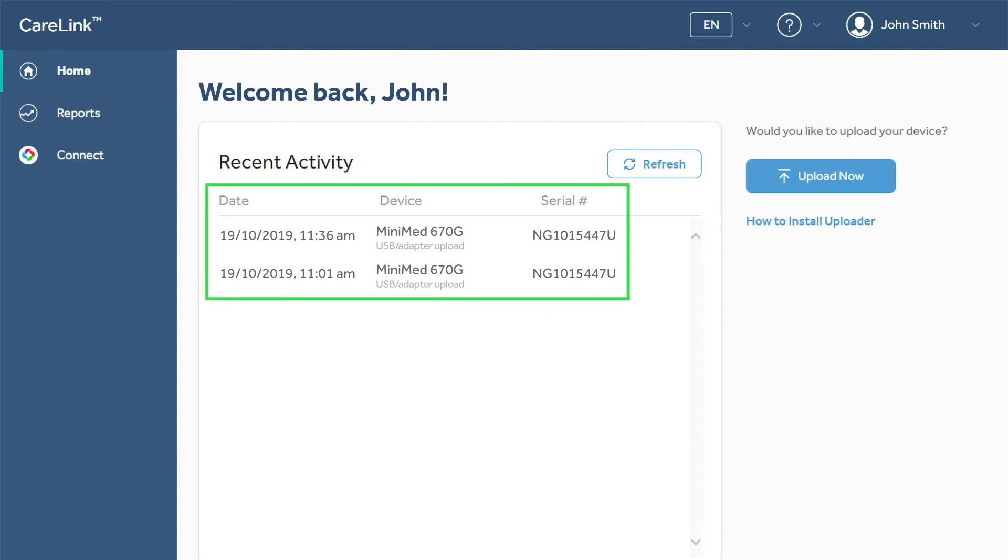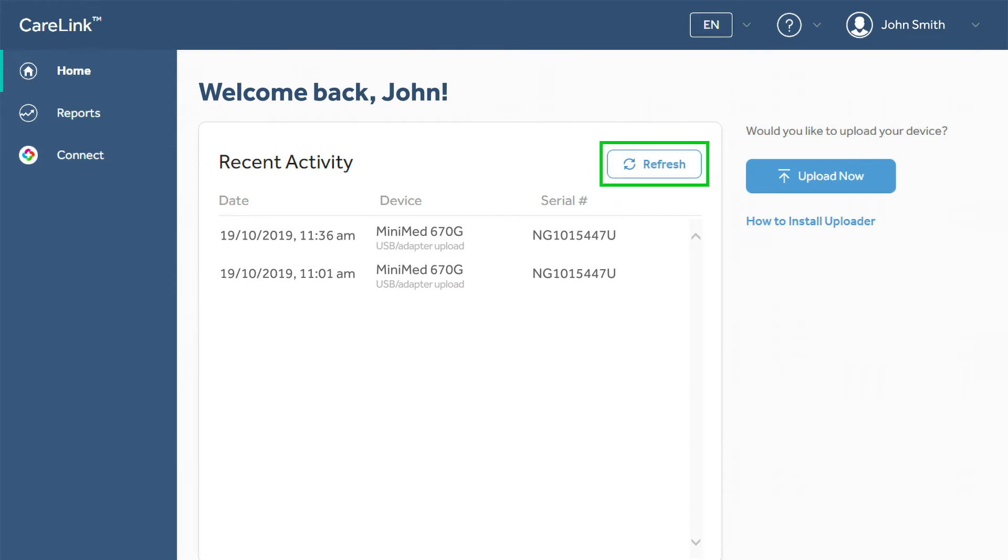You should see your most recent uploads in the center of the window. If not, click Refresh to reload the history. You can access this screen at any time by clicking on Home.